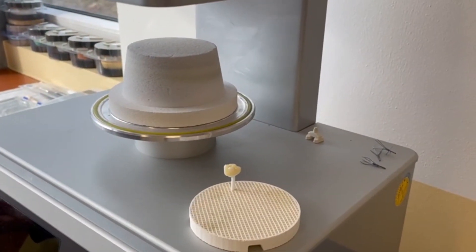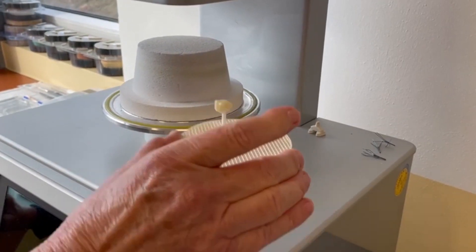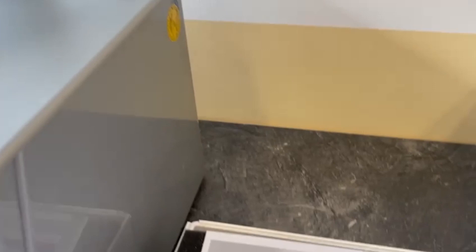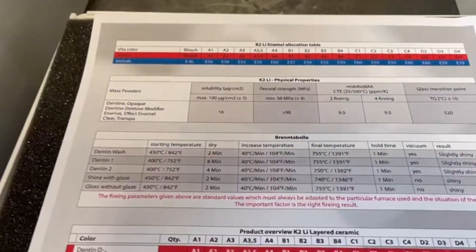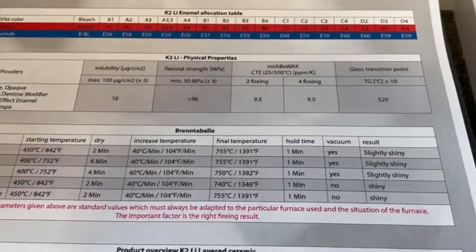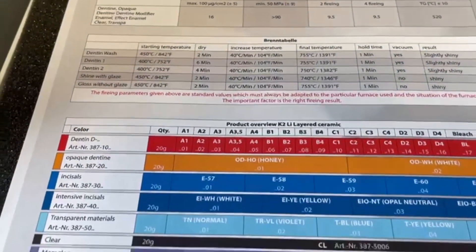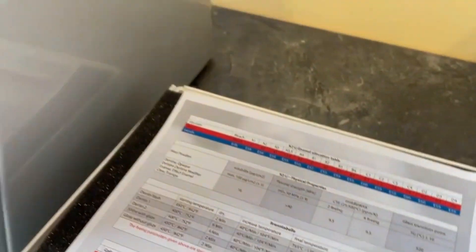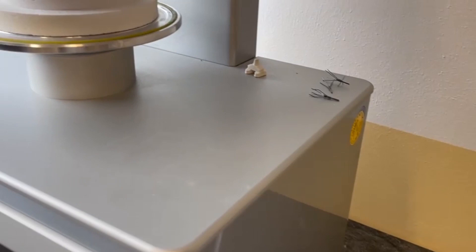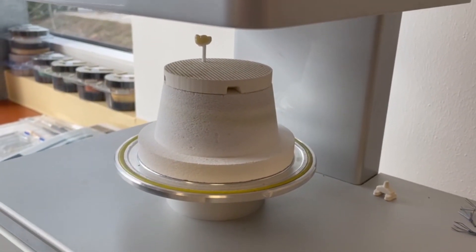We set it in the furnace. You have to respect the firing sheet from each ceramic producer. If the firing paste instructions are respected, don't worry — you will have no colorization after firing. Some minutes later you can take it out. Okay, Andrea, please take it out.